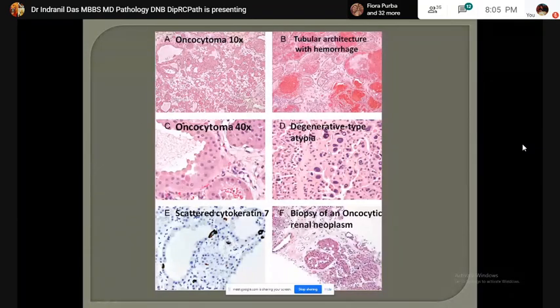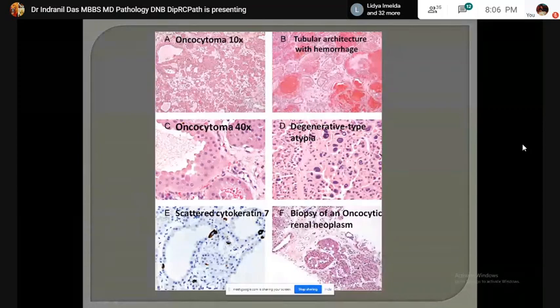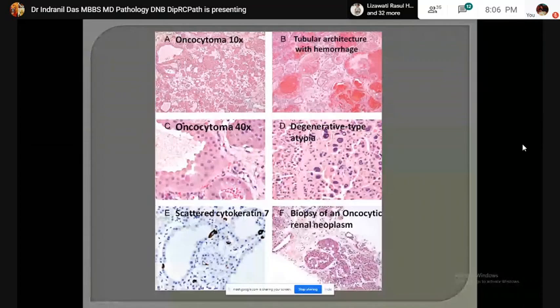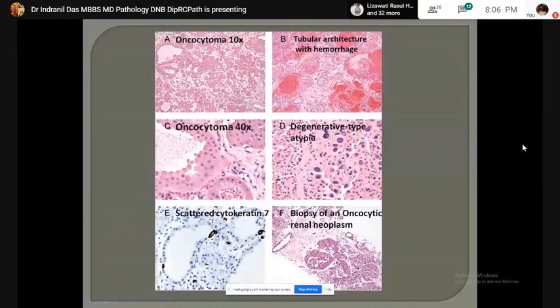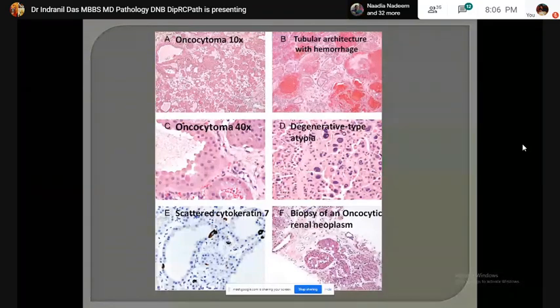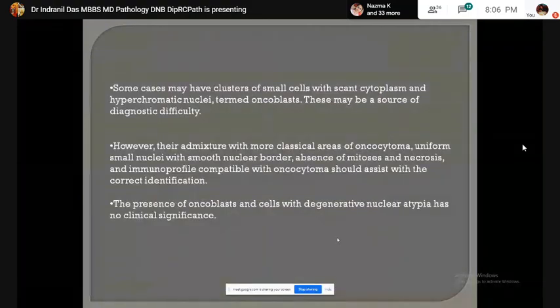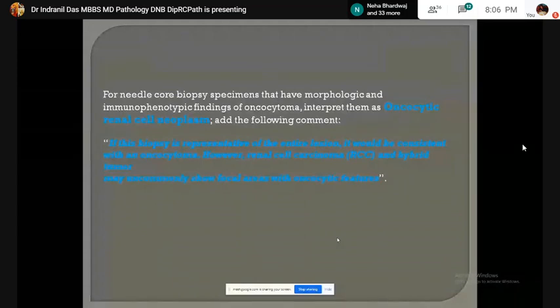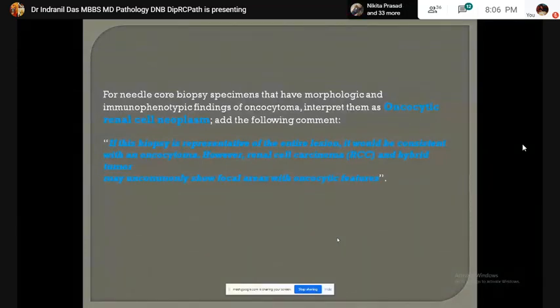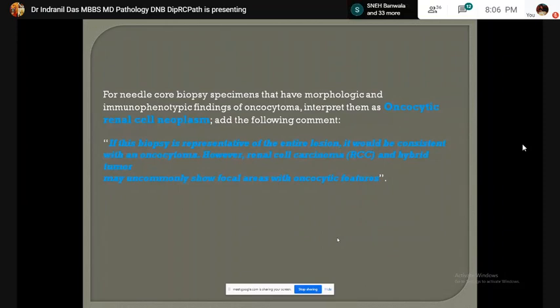This shows oncocytoma with degenerative change — smudgy and hyperchromatic nuclei. CK7 shows patchy positivity or may be negative. Sometimes it may not be possible to differentiate oncocytoma from chromophobe RCC on needle biopsy specimen because of the scant tissue. In that case, for core needle biopsy specimens with morphologic and immunophenotypic findings of oncocytoma, interpret them as oncocytic renal neoplasm and add the following comment: 'If this biopsy is representative of the entire lesion, it will be consistent with an oncocytoma. However, renal cell carcinoma and hybrid tumor may uncommonly show focal areas with oncocytic morphology.'